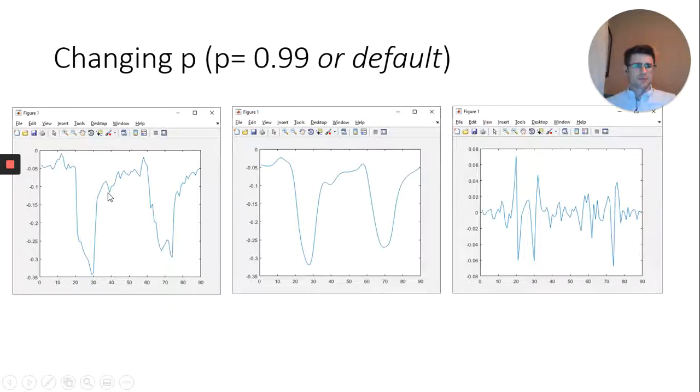So that's the spline itself. At least to me, it was a big mystery because it's called spline, and I didn't understand what the heck that meant. But the idea behind it is quite simple. It's just saying, okay, we're going to model the data, and we're going to do it with a fairly complex shape. Then we're going to look at the difference between the shape and the actual data. That difference, we can assume, is not the motion. Whether or not that assumption is right is questionable, but the idea is fairly simple. And what it gets you is a fairly useful tool to attack motion artifacts.